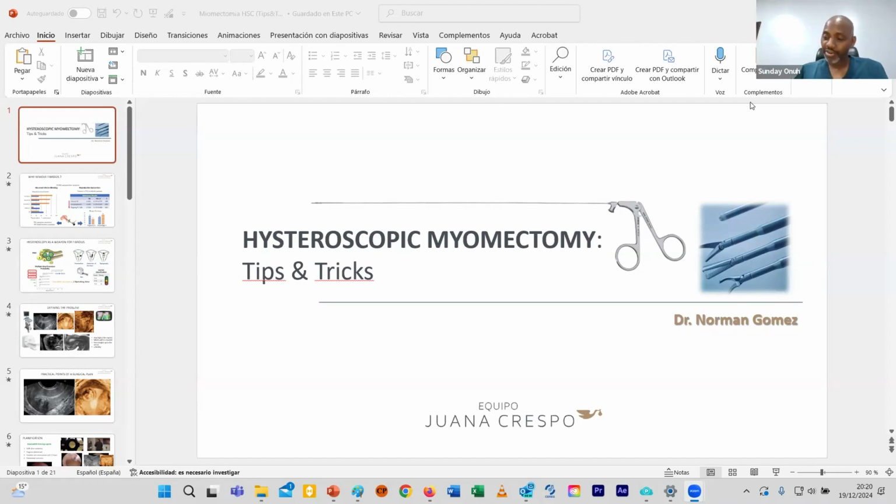Okay, that's fine. Another question is, do you use the Covidien Elite TrueClear for your 3mm instruments or the Bigatti shaver? No, we use the Covidien, the Medtronic TrueClear system device, which is the bigger one. It's 4 millimeters for the operating channel and 7.2 millimeters for the external sheath. Okay, good. There's a question too: apart from the TrueClear, are there regular hysteroscopes that can accommodate the 3 millimeter instruments?